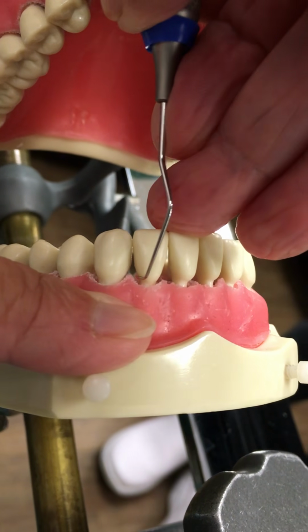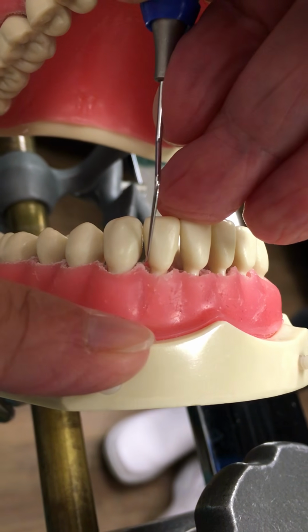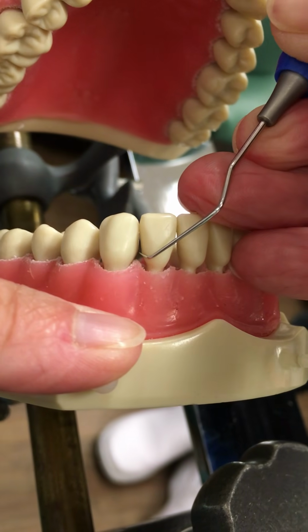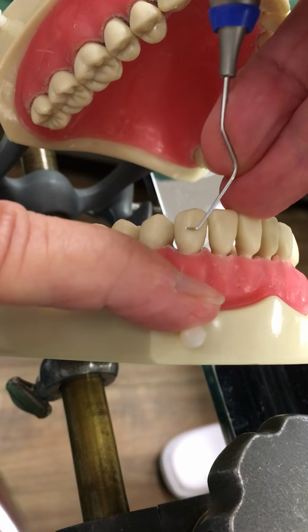So as you come around the corner, you lean your hand in that direction so that your shank is parallel with the long axis of the tooth. Otherwise, if I don't, my shank is going to be laying down. You see that? And it's supposed to be parallel. Oops, sorry. Move your mannequin if you need to.